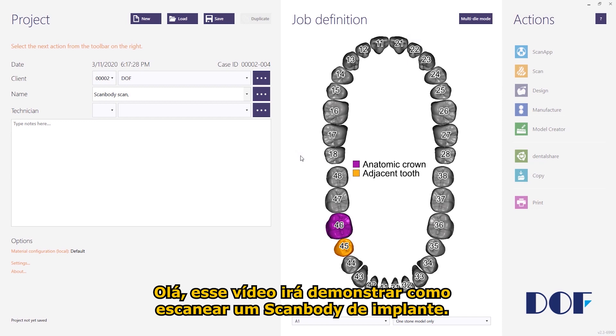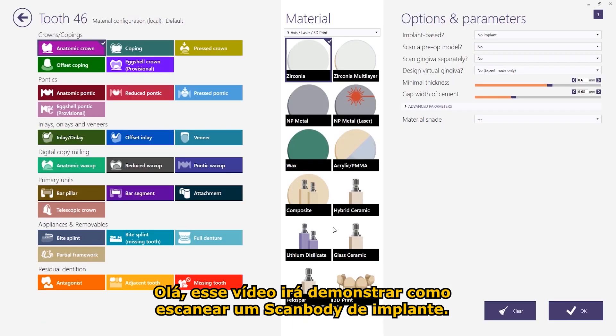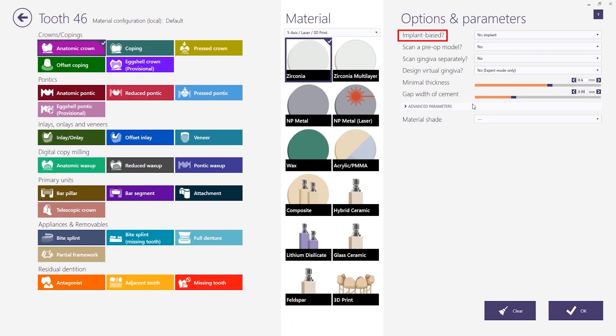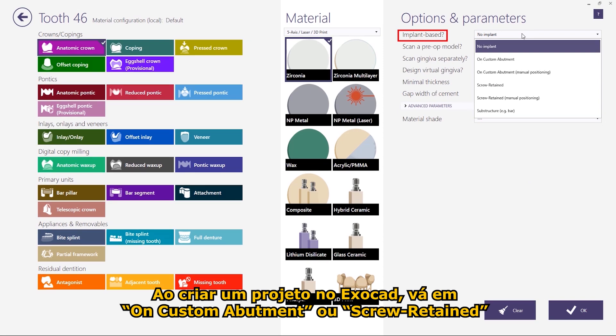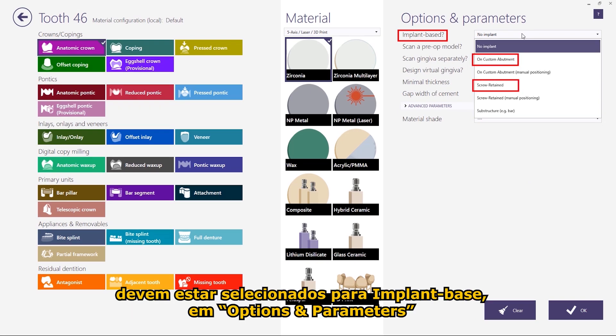Hello, this tutorial will guide you on how to scan an implant scanbody. When creating an Exocad project, custom abutment must be selected for implant-based work under Options and Parameters.